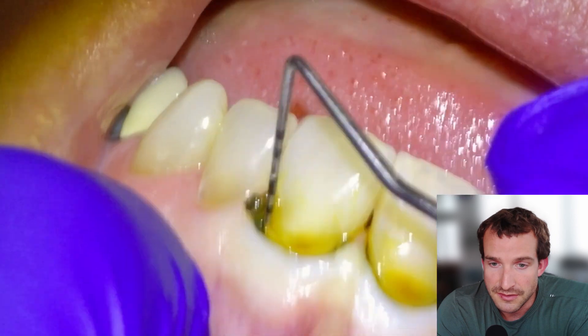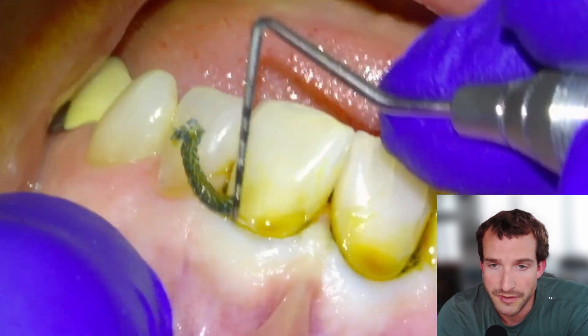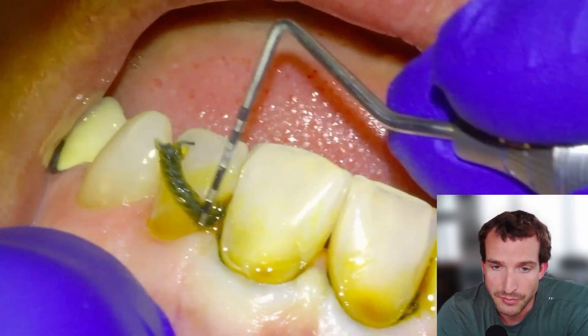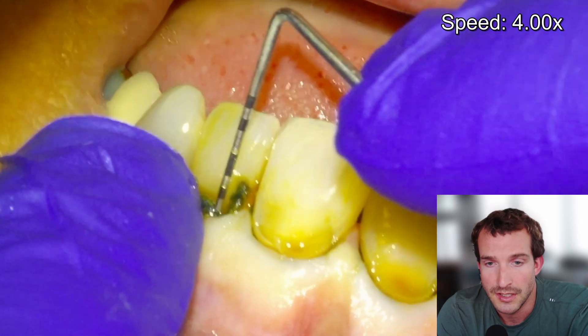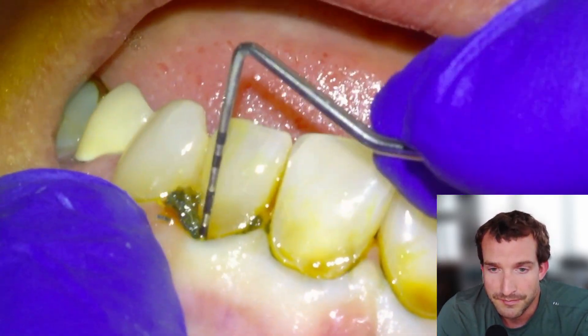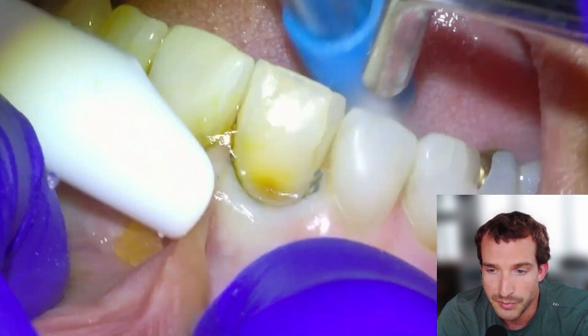This was for aesthetics — we pitched the idea and they said sure, let's do it. We'll get them in, freeze them, and this is a procedure that takes half an hour — very high yield for aesthetics compared to how non-invasive it is. This cord is going to be a little stinker to pack, so we'll pack it into the sulcus once we get the first little bit down, and then the next step is just going to be to pumice the surface of the teeth.